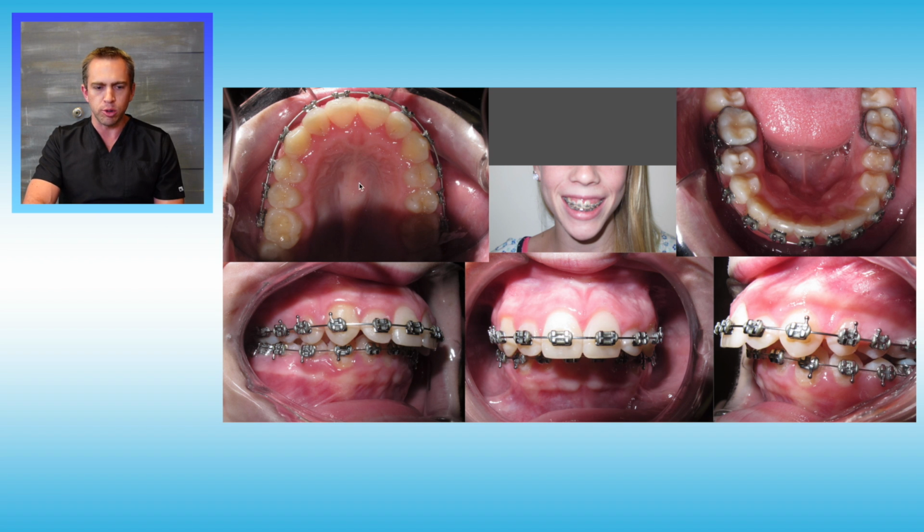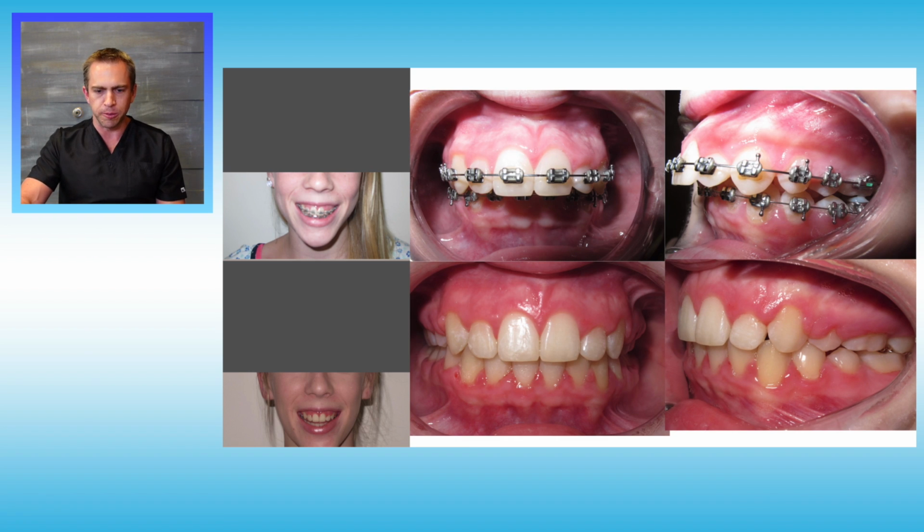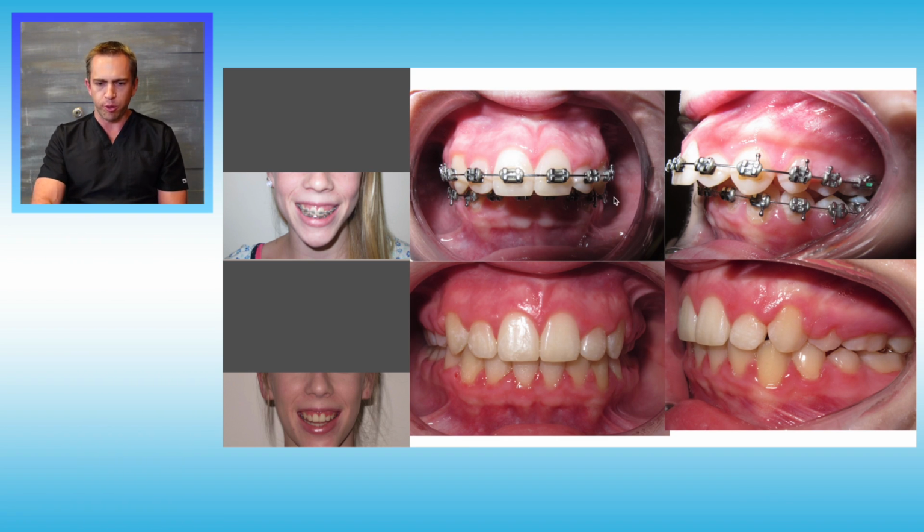And so we took out 2 teeth on her upper arch. And then about 12 months later, you can see the overbite was totally corrected. This is where the teeth were extracted. And as you can see, the space is completely closed and it's totally transformed her smile. So we'll show you some before and after photos here. You can see the before photos with the large overbite, the teeth were sticking out. Then afterwards, after the space was closed, she had a great smile, space is closed.